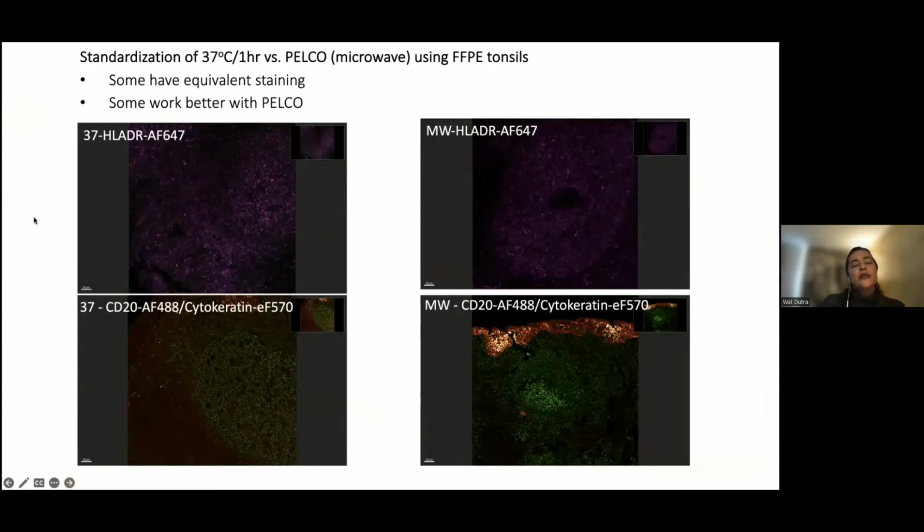One thing that we did, when you do the staining here, Andrea, in her paper, and we also did, was use this microwave, the Pelco microwave. The Pelco is essentially a machine in which you put your sample, your tissue slice on the slide with your little solution of antibody on top of your tissue, and you put it in this microwave. And it sort of works as a correlate of a PCR machine.